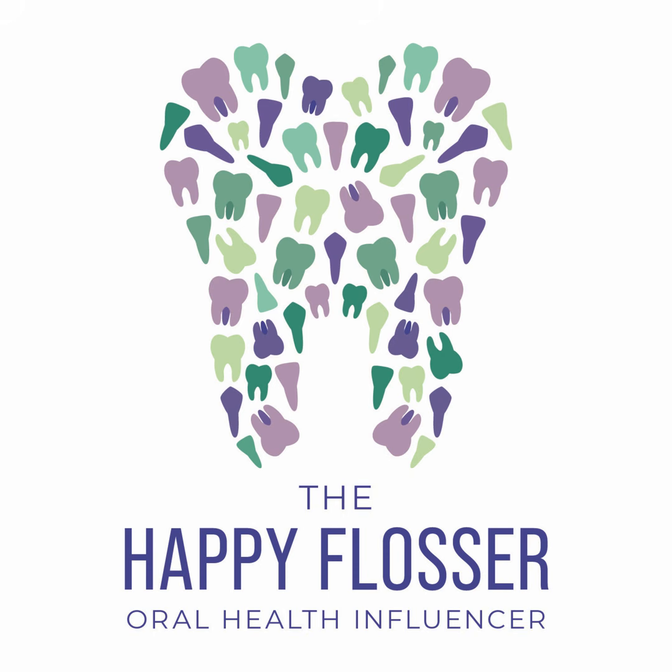And that's when you find out that the tray is too small. And even worse, that might be when you find out that the tray is too big and you can't even get it in their mouth. So always do a dry run to make sure that you are using the right impression tray and that you're able to still get all of the really important anatomical landmarks without impinging on the soft tissues anywhere.